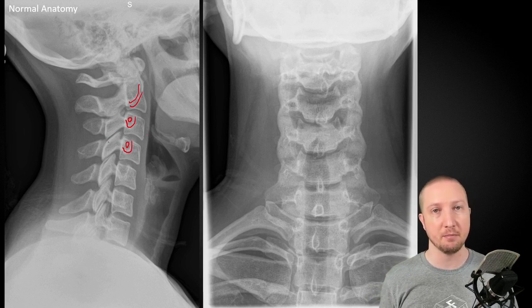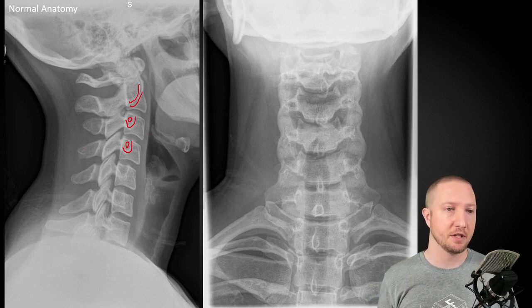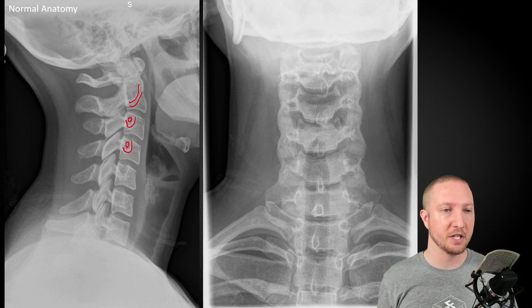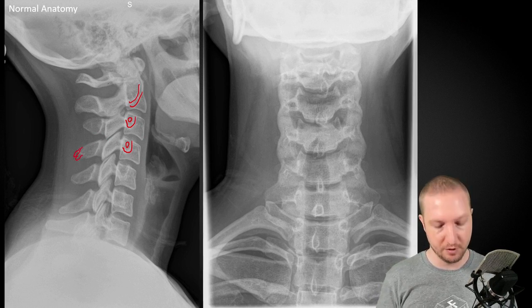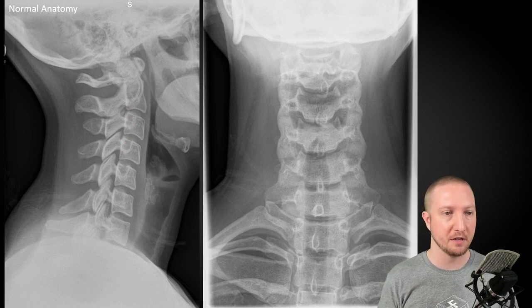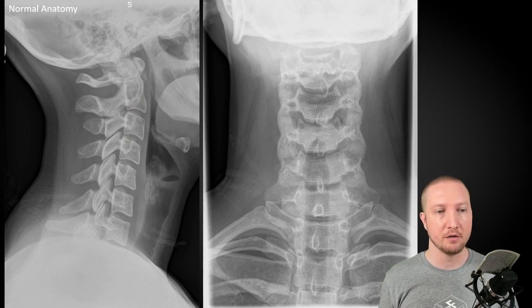Our cervical spinous processes are bifid — this person's are not super bifid — but we expect to see some little tubercles coming off, and these can be in various orientations depending on how they're structured.